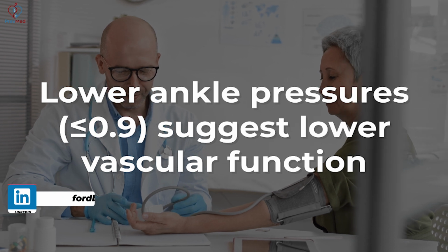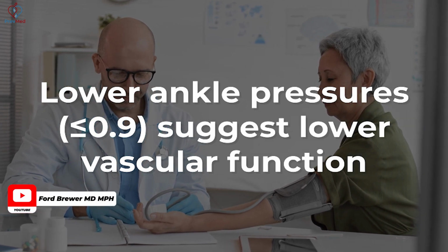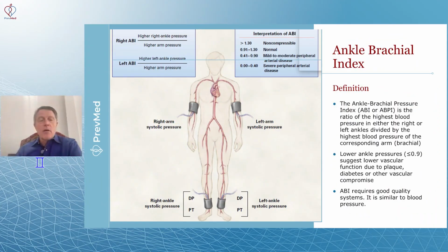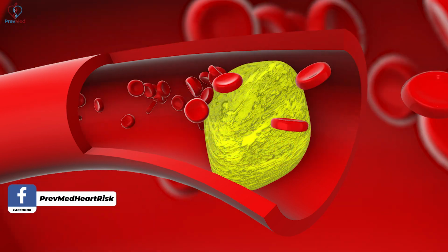A lower ankle pressure, less than 0.9, or 90% of what you see in the arm, suggests a lower vascular function. Now, why would that happen? Well, just look at it visually. If you've got a whole bunch of plaque in those arteries, especially in these arteries, as they go through this, called the iliac and femoral arteries and down into the tibial and lower leg arteries. If you've got a lot of plaque in this area, as you can imagine, what you'll get is decreasing blood pressure because it's going to be pushing through plaque.